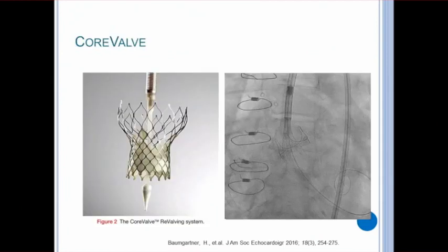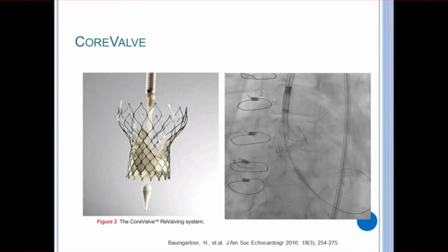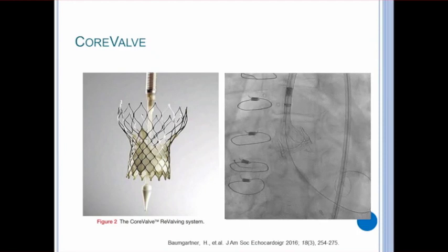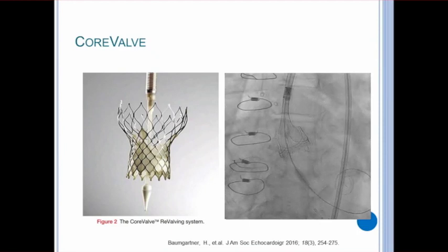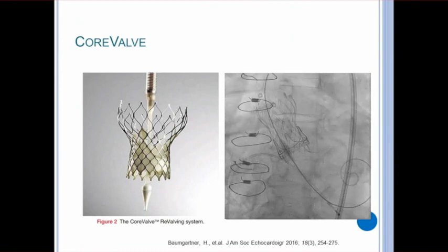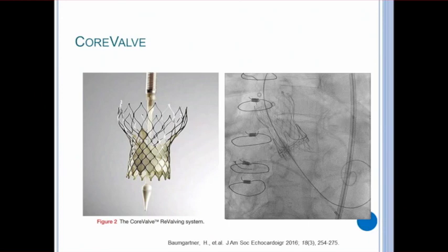The other valve in use is the CoreValve, a self-expandable valve that can be slightly adjusted until full deployment. On the right is a cine of a CoreValve deployment. The catheter is pulled back and the valve expands to adhere to the annulus. And this is what the CoreValve looks like once fully deployed under fluoro.